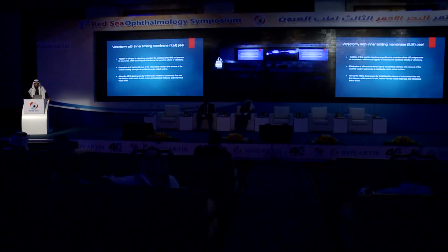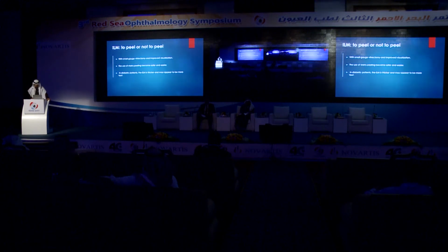It will also allow the macular edema to decompress and the extracellular fluids into the vitreous cavity, restoring normal retinal thickness. It is generally advisable for all diabetic patients to peel the membrane. And the big question, whether to peel or not to peel, we think with the advent of the small gauge vitrectomy, the improved visualization, the use of stains that is becoming safer and easier, and the fact that the membrane is thicker in diabetic patients, peeling of the membrane is probably more appealing.